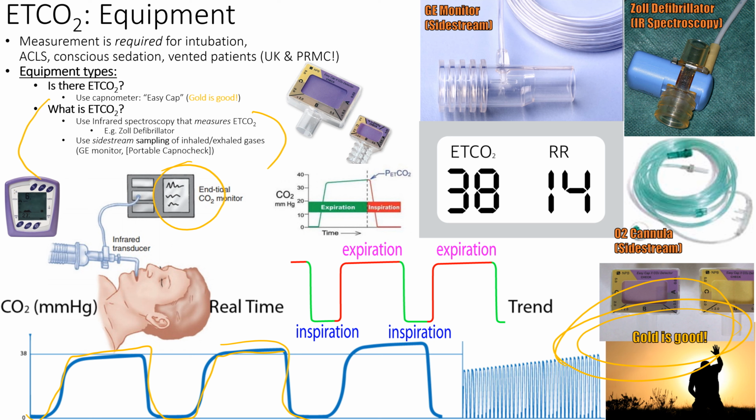Because with esophageal intubation, it could turn yellow if they had a recent Diet Coke, or a lot of aspirates. So we want to make sure we have a waveform that doesn't just start plummeting because of a lack of exhaled CO2. After 6 to 8 breaths, usually the Diet Coke goes away. So that's why you want to have waveform capnography.